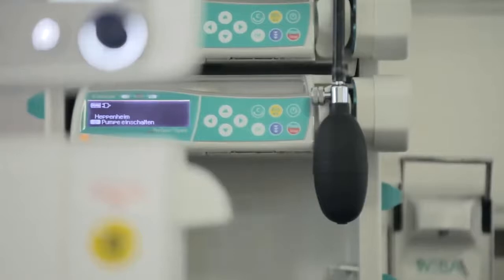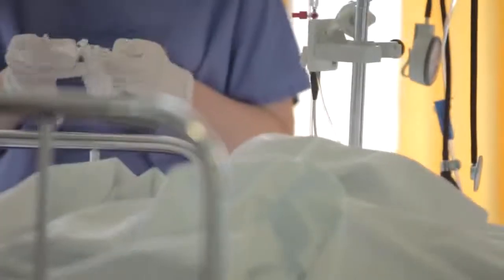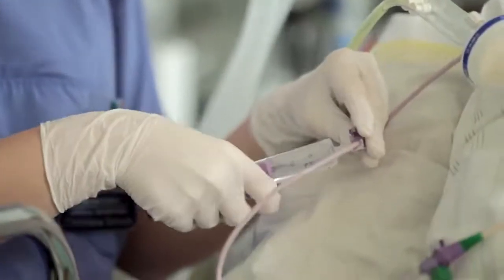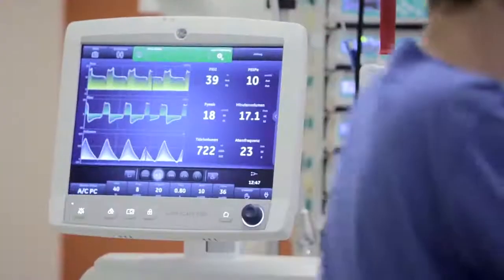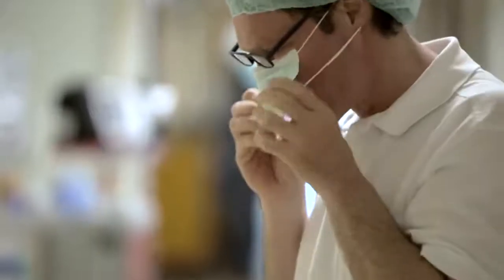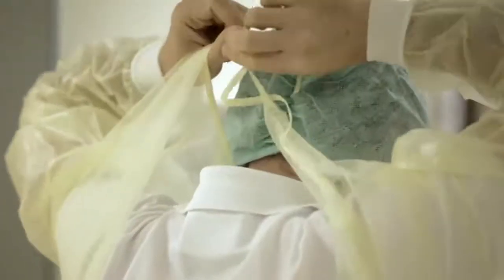My goal was to implement an individualized lung protective strategy in our ICU. In the older days, we had only statistical approaches to treat our ventilated patients. That means there was obviously the risk for the individual patient of a harmful treatment, for example with a ventilator-induced lung injury. We know that every invasive mechanical ventilation therapy is potentially harmful for the patients.